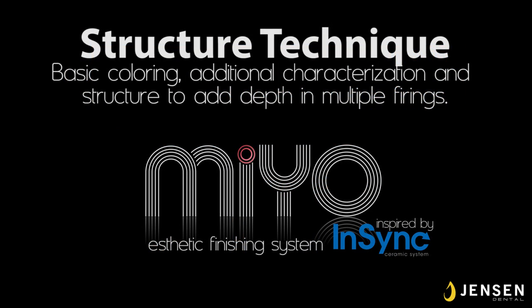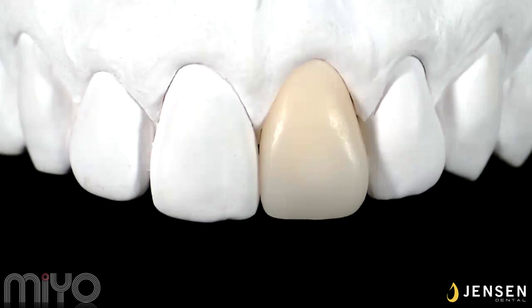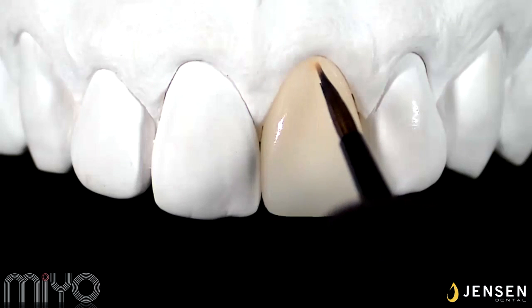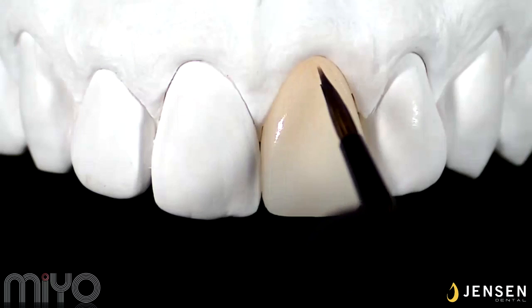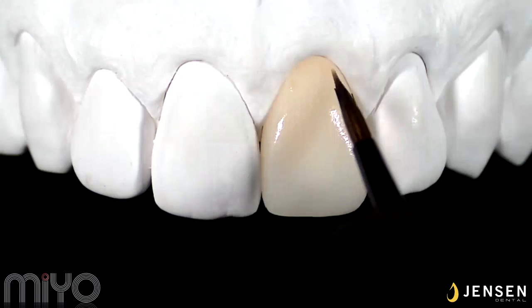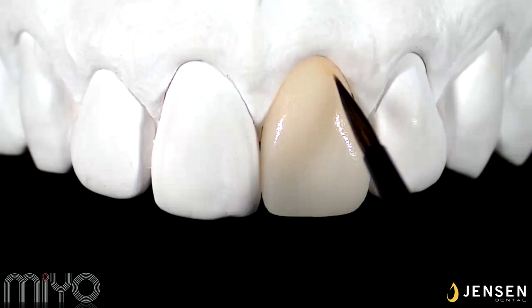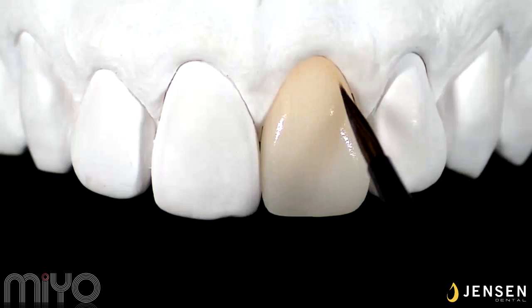This will be a short introduction of structure technique using MiYO system. It's very important to apply a thin layer of glaze liquid to allow the colors to flow and break the surface tension before any kind of application. Translucent clementine is applied in a dab and dragging motion near the gingiva region. Now this already creates a subtle contrast, almost making a brightening effect to the body 1/3 region.